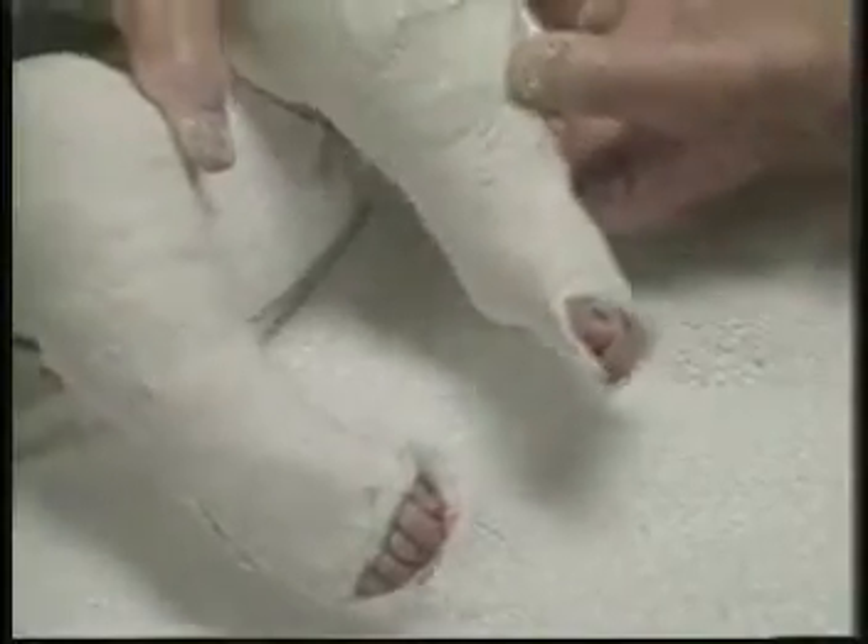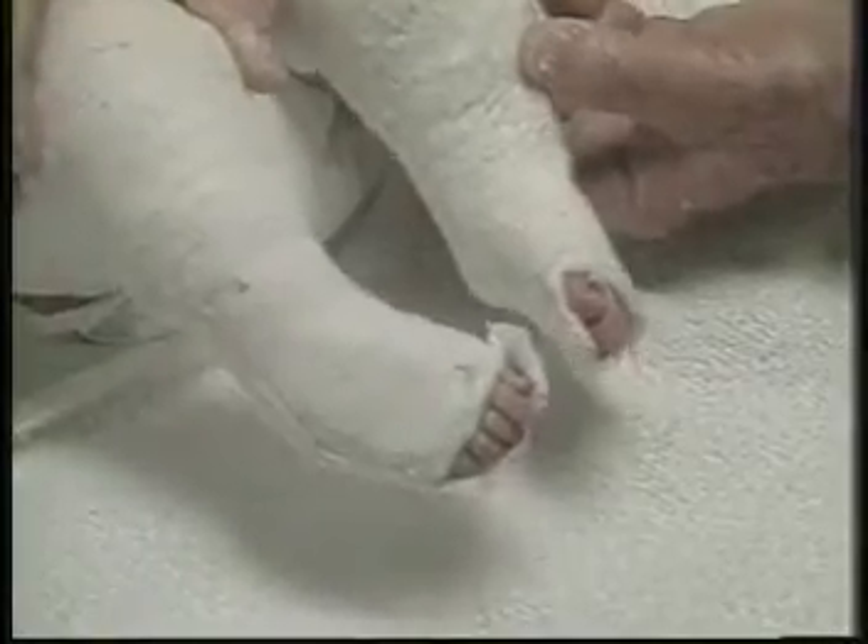A plaster bandage is applied over my fingers that are holding the baby's toes to prevent crowding them. The foot and heel are carefully molded while rolling the plaster bandage. In the finished plaster casts, observe that the feet are supinated. The plaster over the toes is trimmed off.